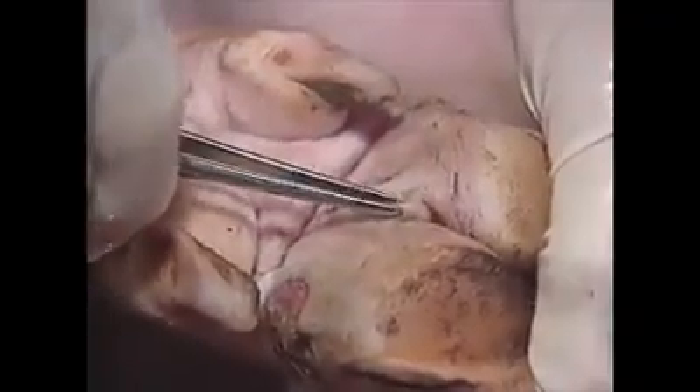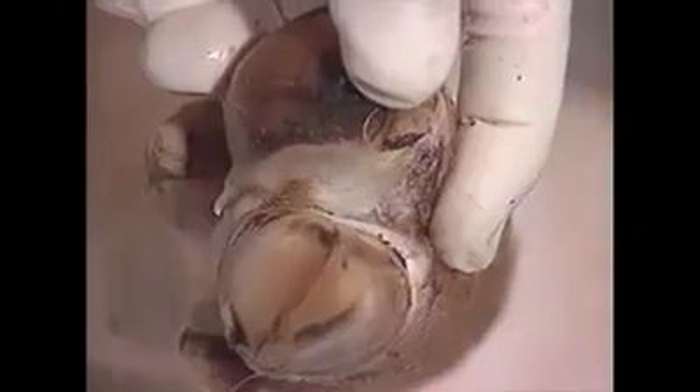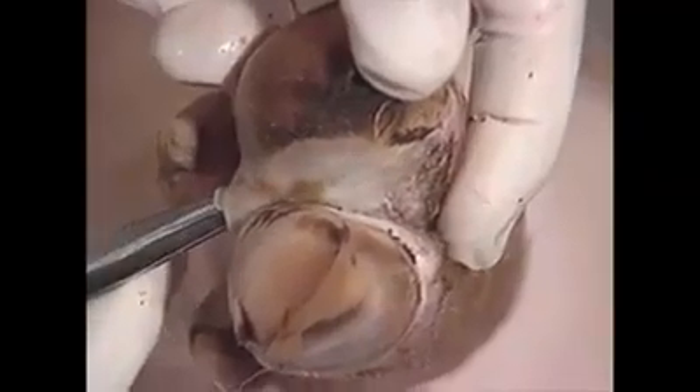When aspirating a vesicle, introduce the needle in a normal area of skin and then enter the vesicle from the bottom. Vesicular fluid contains a very high titer of antigen and virus and is thus an excellent diagnostic specimen. This is loose skin of a large ruptured vesicle — note the size of the lesion. This vesicle involves the whole interdigital space. Note the blanched white appearance of the skin over the vesicle. If trimmed off, the loose skin makes an excellent diagnostic specimen. This is the interdigital vesicle as seen from the front of the claw. Note the whiteness of the coronary band and the hyperemia of the skin proximal to the vesiculated coronary band.